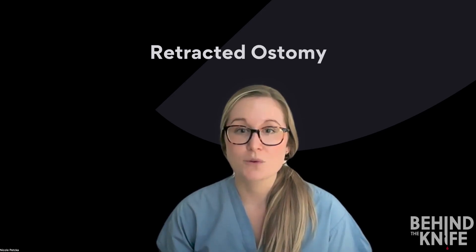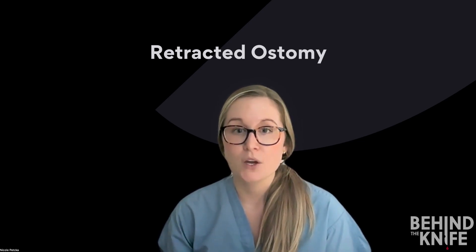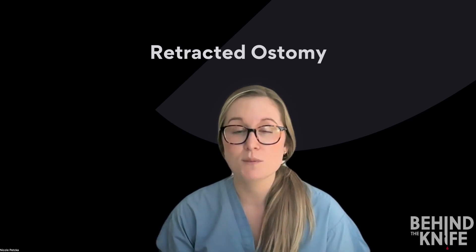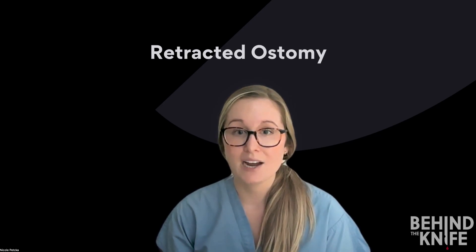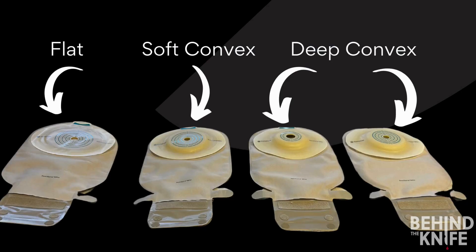Next, let's talk about how to manage a retracted ostomy. A retracted ostomy occurs when the bowel is pulled back into the abdomen, creating either a very small lip of stomal tissue visible above the skin or causing the stoma to be flush with the skin. Ostomies can be at high risk of retraction if they're placed in skin folds. The trick for managing a retracted ostomy is changing from a flat appliance to a convex appliance. Convex appliances have an extra lip of material circumferentially around the opening, which provides inward pressure on the abdominal wall and helps the ostomy to protrude outward and flatten the surrounding skin folds.